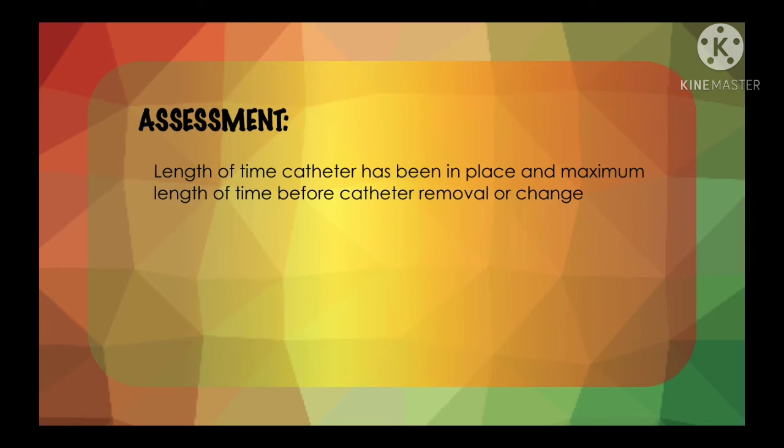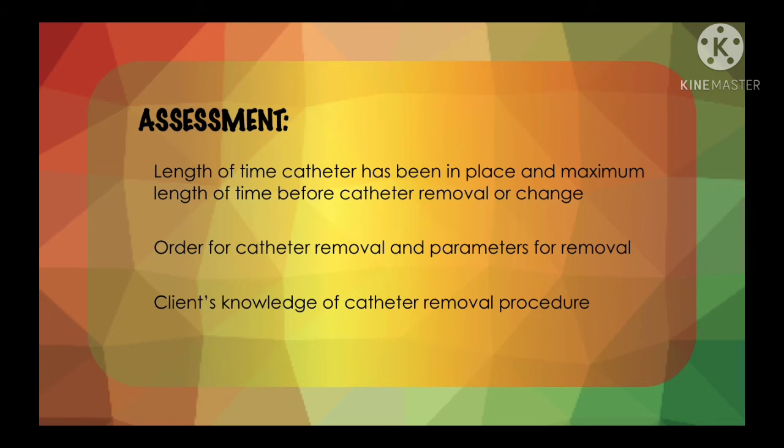So first is assessment. So assess the length of time the catheter has been in place and the maximum length of time before the catheter removal or the change of catheter. Order, doctor's order for catheter removal and parameter for the removal. Client's knowledge of catheter removal procedure.